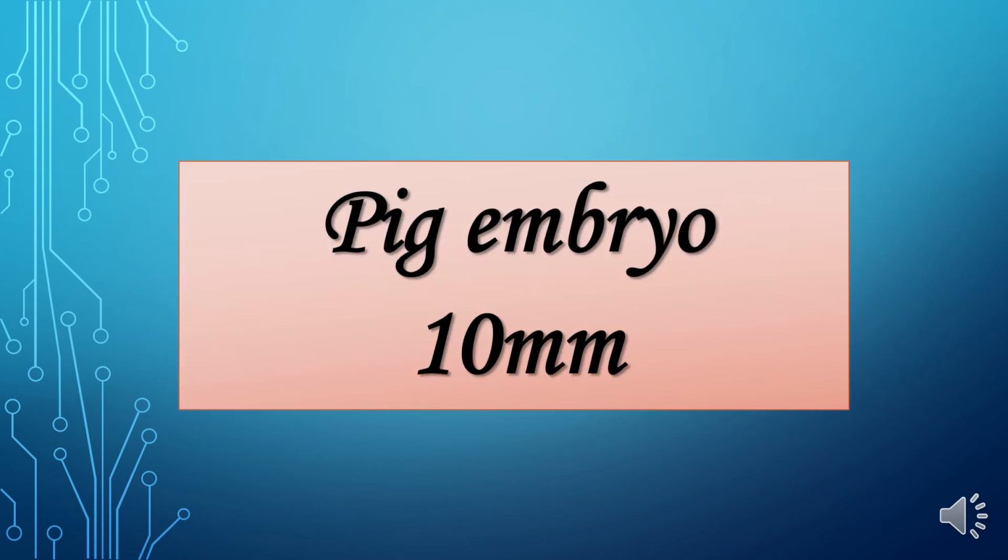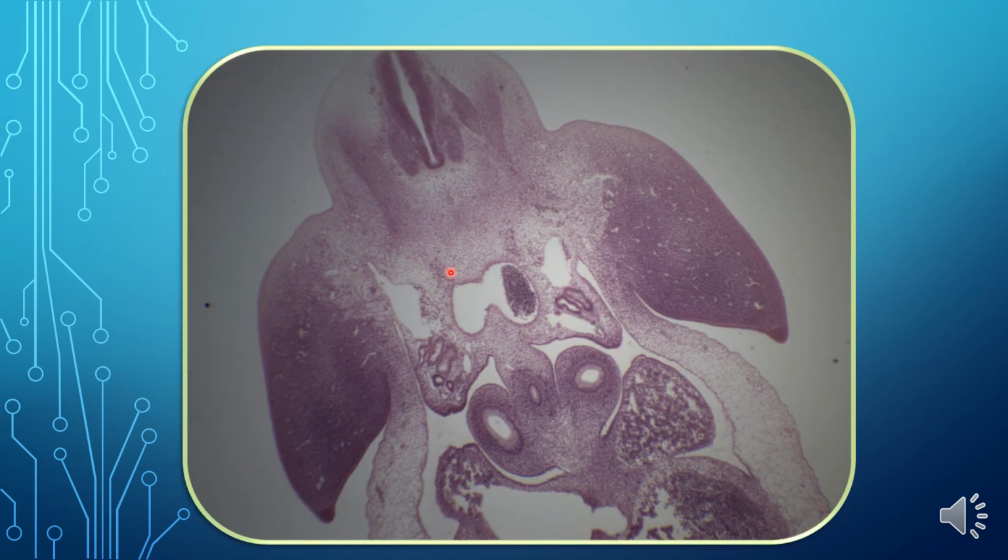Today in the lab I will talk about the practical embryology of the renal system. In this 10 millimeter embryo, the slide shows serial sections of the embryo. Dorsally is the neural tube, with the basal mantle zone and dorsal root ganglia.